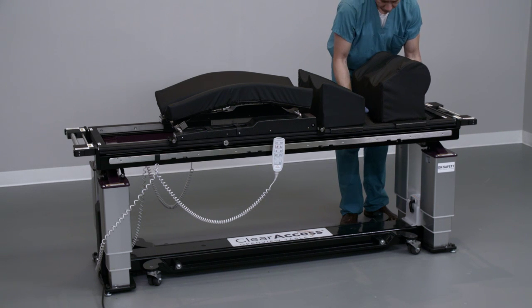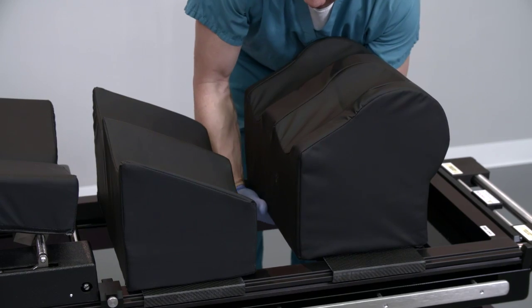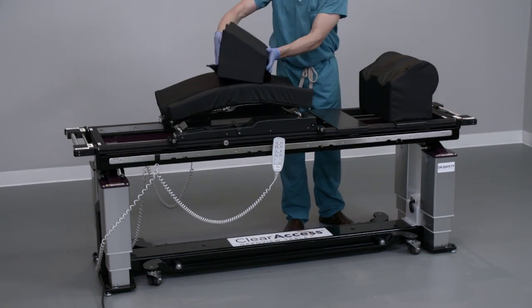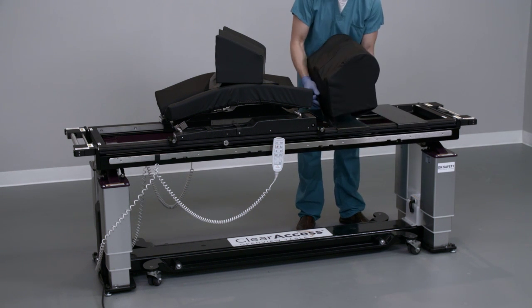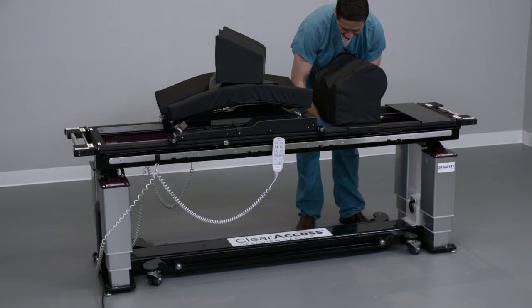Repeat the installation procedure with the ankle rest on the carbon fiber support closest to the foot end of the table. For patients shorter than 5 feet 10 inches, it may be preferable not to use the thigh pad. If this is the case, remove the thigh pad and advance the ankle rest forward to the head end carbon fiber support.